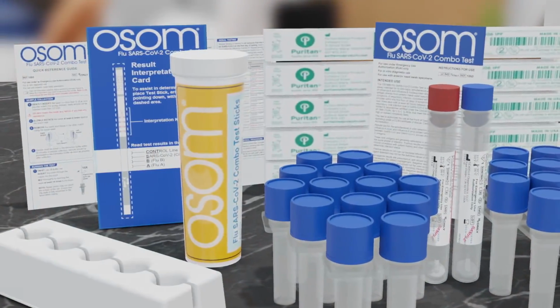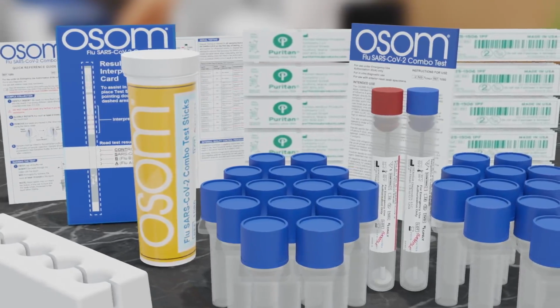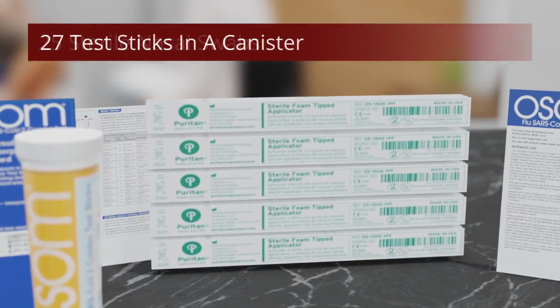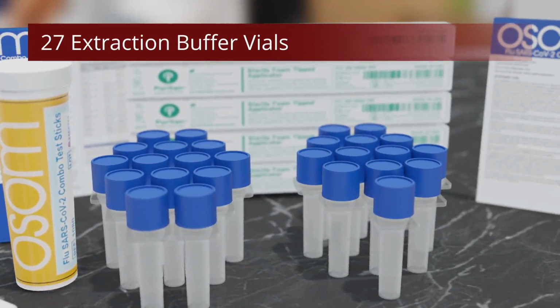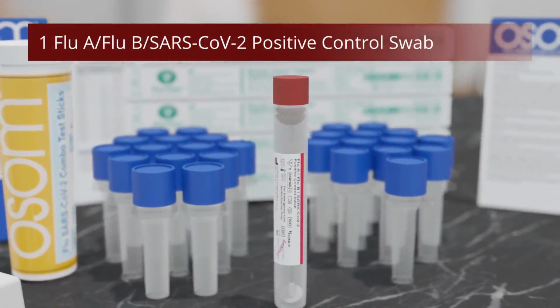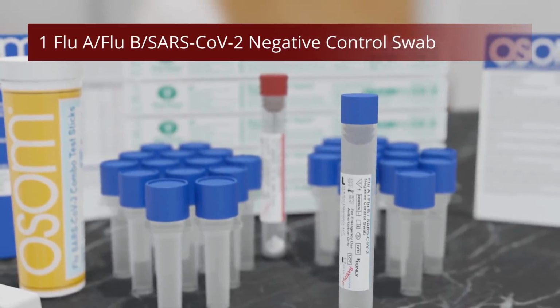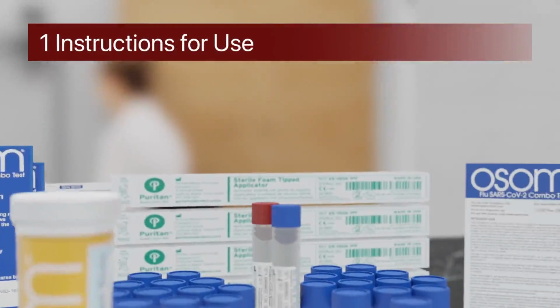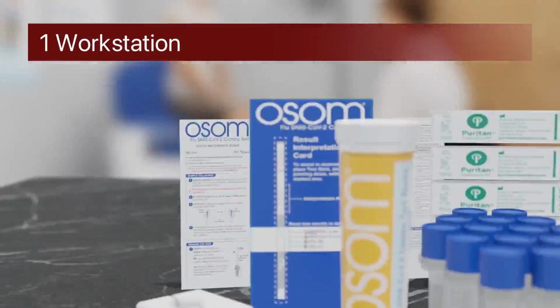This video explains the procedure for using the OSOM flu SARS-CoV-2 combo test. Each kit contains 25 sterile nasal swabs, 27 test sticks in a canister, 27 extraction buffer vials, 1 flu A, flu B, SARS-CoV-2 positive control swab, 1 flu A, flu B, SARS-CoV-2 negative control swab, 2 result interpretation cards, 1 instructions for use, 1 quick reference guide, and 1 workstation.